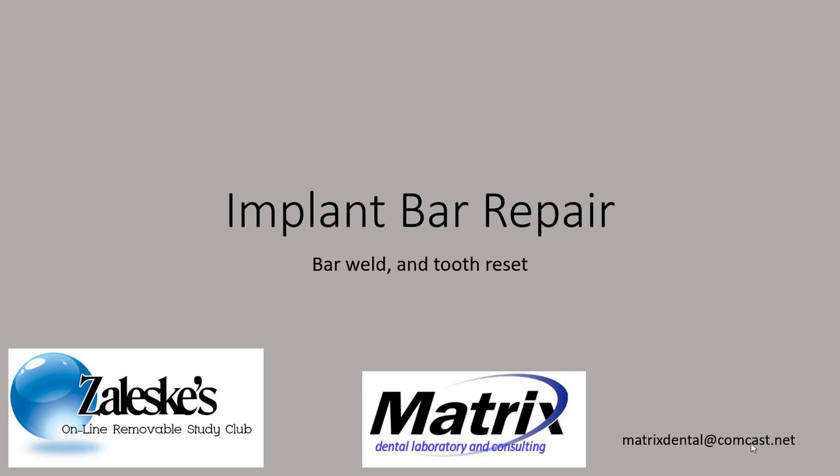Today's technique has to do with implant bar repair. We get a lot of these from cases that we inherit through new accounts, basically. At least that's the way I get them. New doctor, and then I inherit all the things that were done prior to my introduction to the doctor.